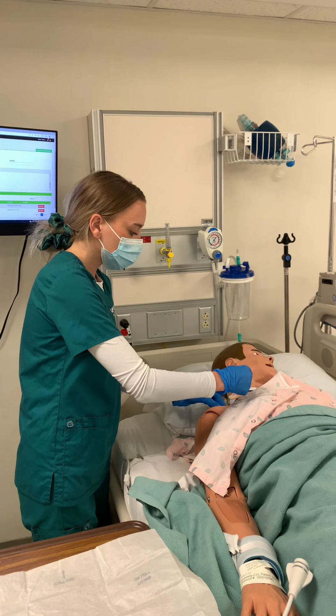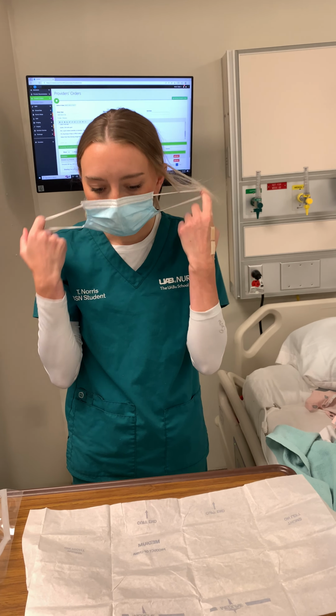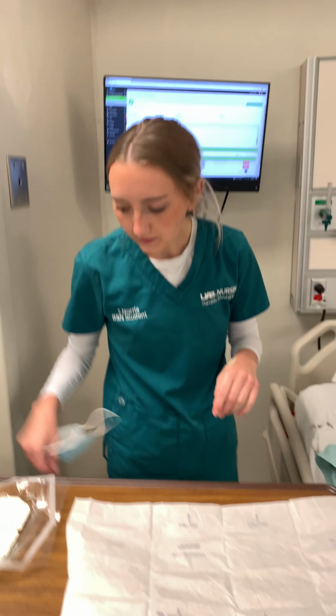And once that is on there very well, we're now going to just dispose of our gloves and our mask. And I would throw that in the trash can. And now we're going to go ahead and label the new dressing with the date, time, and initials. And once that has been done, now we're just going to go ahead and fix our room back to how it was and check on our patient. So we're going to dispose of all these supplies appropriately.